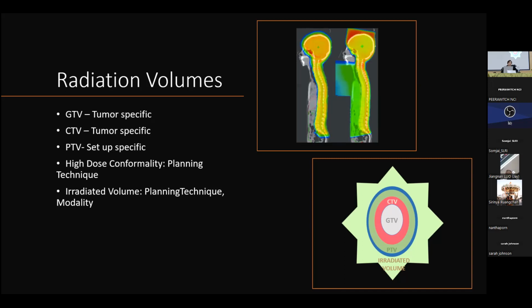Some terminology we use in radiation therapy: a GTV is usually what we call the gross tumor volume. This is the thing you can see on your imaging, either your CT imaging or your MR imaging. Your CTV, clinical target volume. As we all know, the horrible thing about cancer is it also spreads, and it spreads microscopically. So 1 or 2 cells getting away from that tumor and spreading out is not good, at least leading to metastasis. So there's this volume where the physician usually contours to say this is where they think there may have been some little bit of spread that's not actually showing up in the imaging, but is probably there. And what we want to do is give a lot of high dose to that area where we believe there's a tumor, and ideally no dose anywhere else.